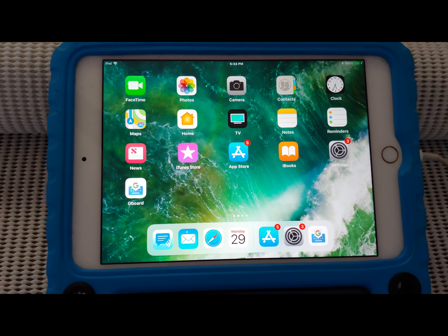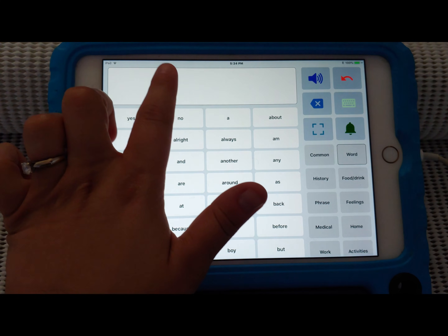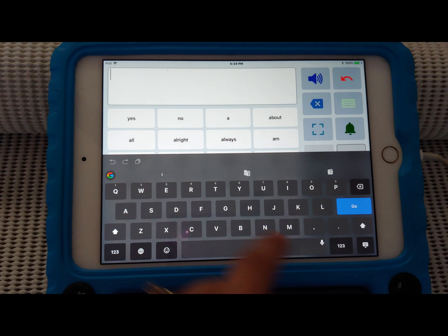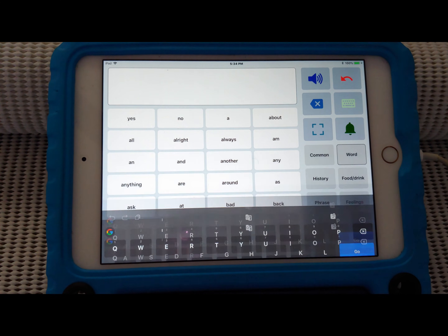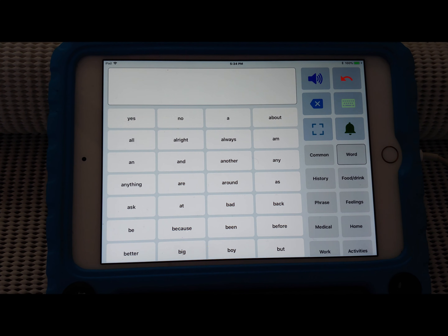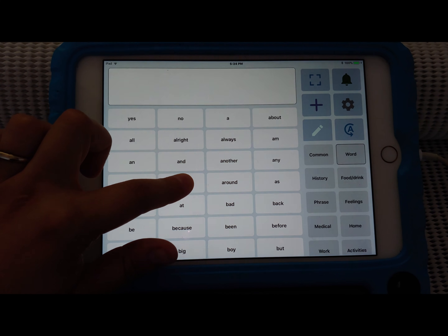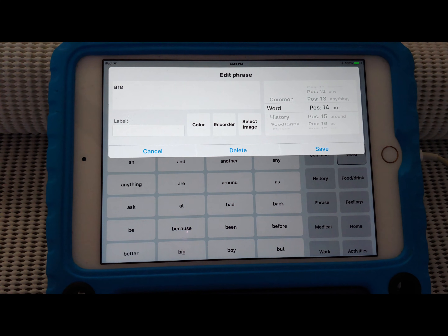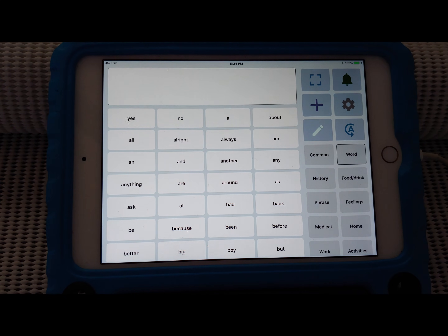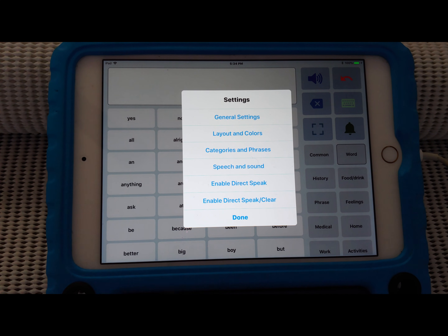To review: we went into the Speech Assistant AAC program. We learned how to write out a phrase using the on-screen keyboard, the quick access phrases, or a combination of both, and have it speak out loud. We went over the attention sound, how to modify buttons, and how to get into the more advanced settings.